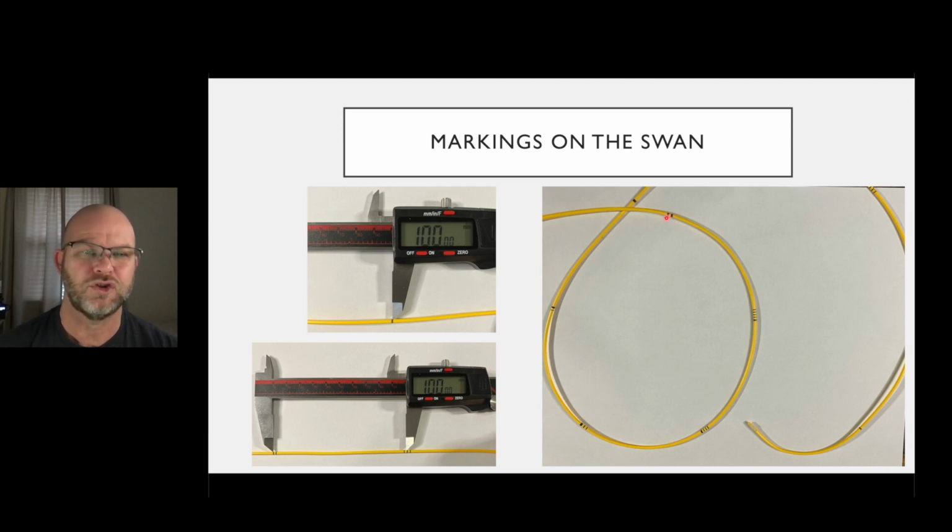And that's when you secure that for patients that you're leaving it in, that's how you can mark where it actually is. And here's the balloon. It's deflated, but that's where the balloon sits.